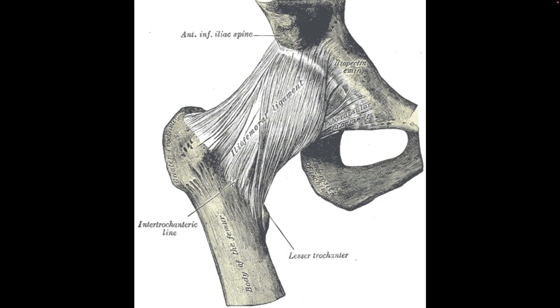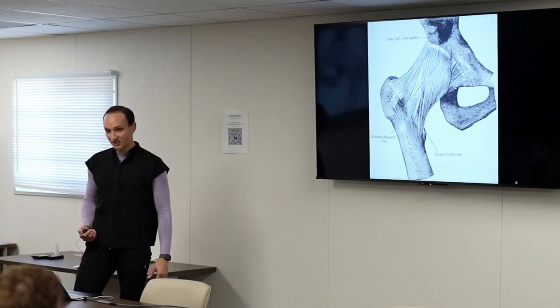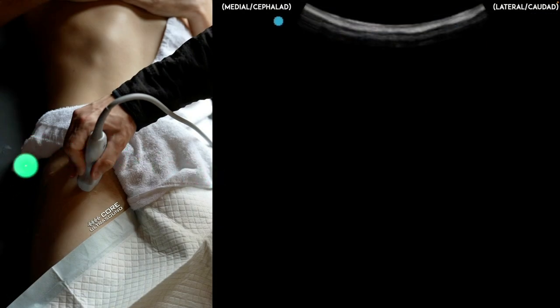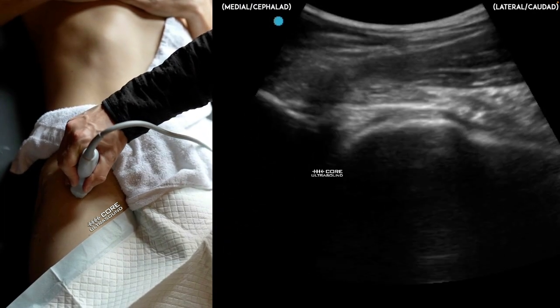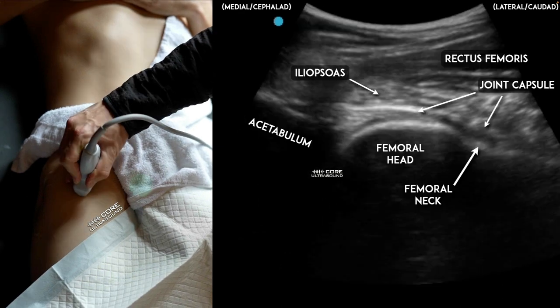Moving on to hip. The hip capsule extends from the acetabulum all the way to the greater trochanter, so it's not just the femoral head we're looking at — we need to look at the entire neck. Your probe placement is tilted to follow the angle of the femoral neck, not straight up and down. I like the curvilinear transducer here because it's usually deeper. Track the femur up, and then tilt the transducer to visualize the head and neck. Remember there's normally a small amount of fluid for joint lubrication — always compare the contralateral side.